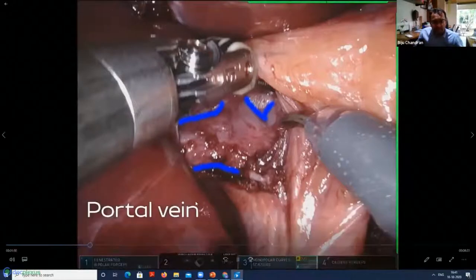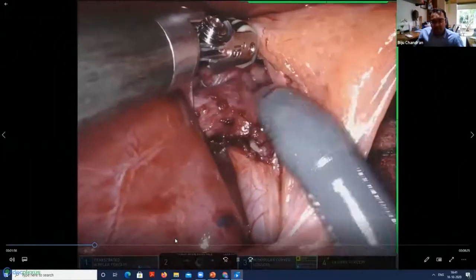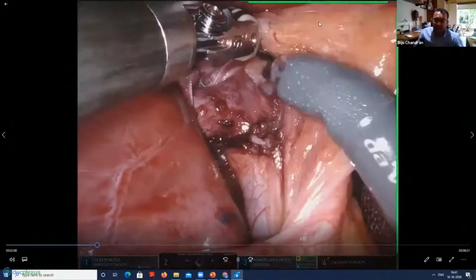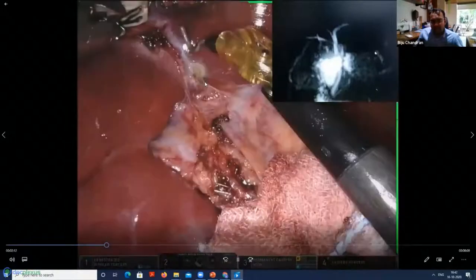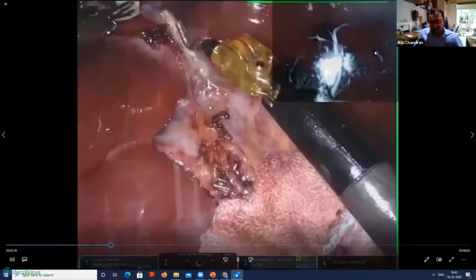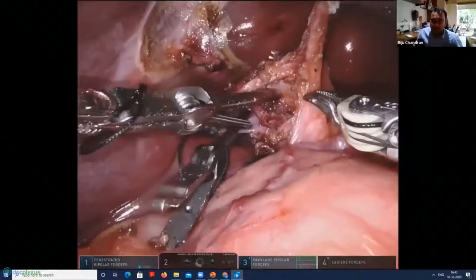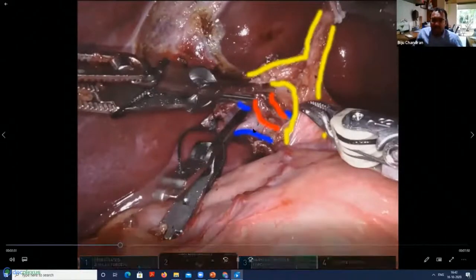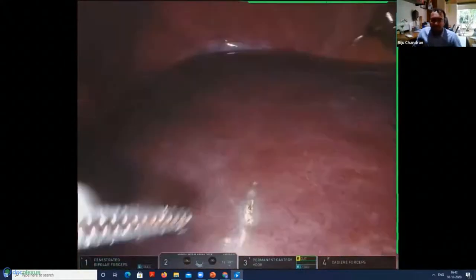Gentle dissection is performed anterior to the portal vein, with the artery on top of it and the bile duct further anterior. This is like a type 3b where the posterior sectoral duct joins the common bile duct. That's the lower part of the parenchymal transection being marked, including the gallbladder area. You can see the bile duct division. The division of the caudate process is done initially because we do not use the hanging maneuver in robotic surgery.